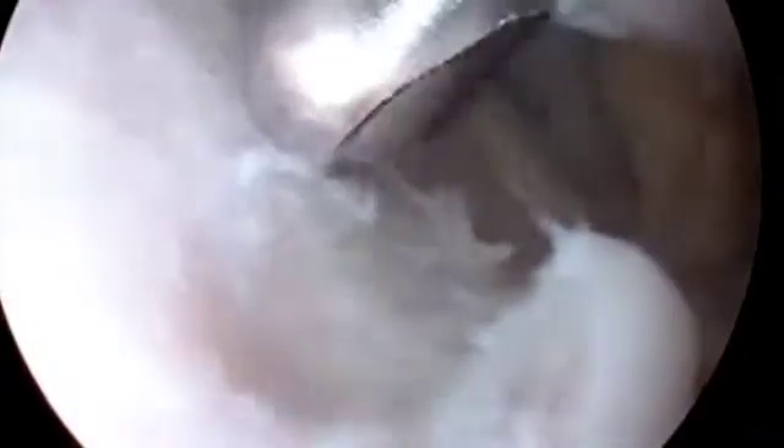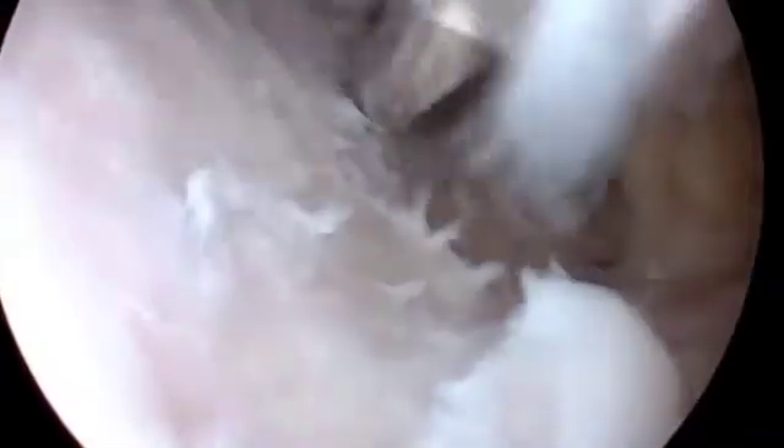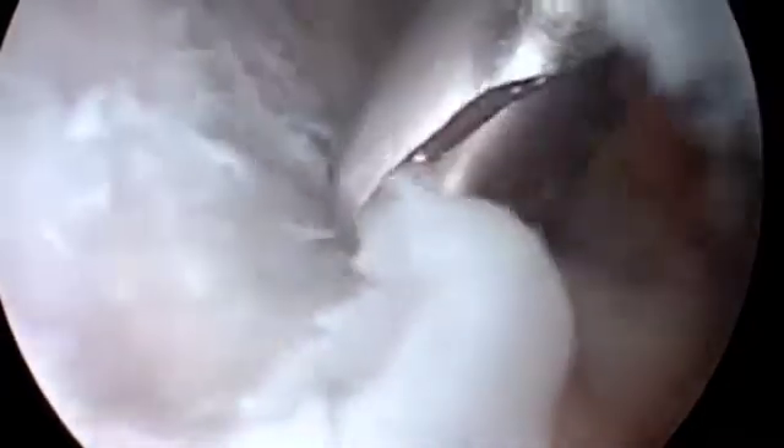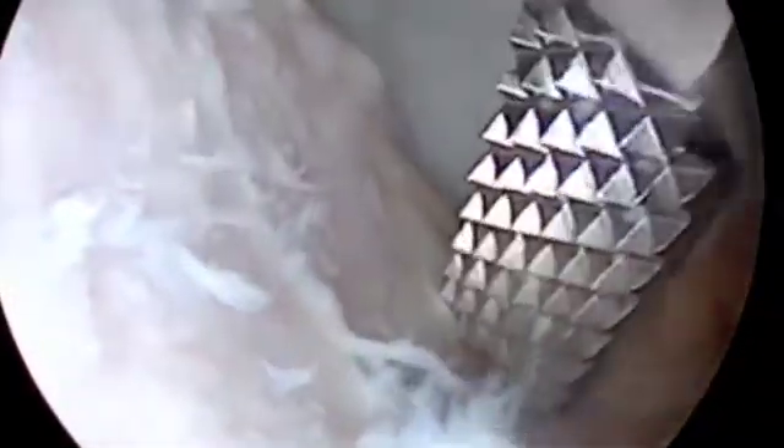The Hill-Sachs lesion is debrided back to a good bed of bone without expanding the lesion — first with a shaver, then with an arthroscopic rasp. Special care is taken to remove only the sclerotic layer of the lesion so that there will be good purchase for the suture anchors.